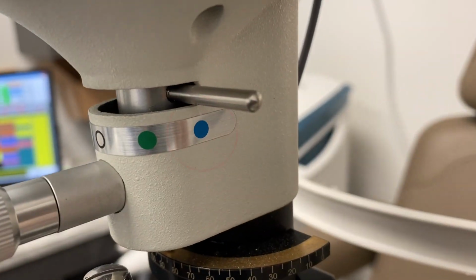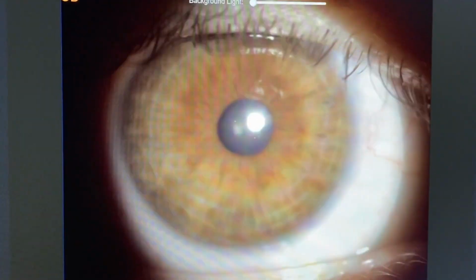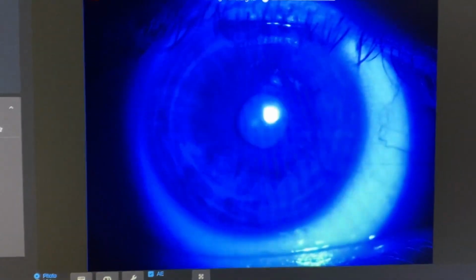This filter is useful when your optometrist or ophthalmologist instills sodium fluorescein yellow dye and we are looking for any abnormalities in the corneal tissue or conjunctiva. The yellow dye absorbs the blue light and then emits green. It really highlights tissue defects for the examiner, whereas it may be difficult to see or sometimes even missed with white light. There's the red-free filter.